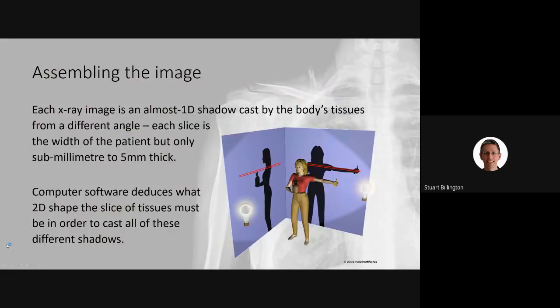Okay. So in a conventional X-ray, if you look at the image on the side of the screen there, the conventional X-ray would show you detail within the black shadow region. So it would be an up, down, left, right image that's taken by a conventional X-ray. But a CT scan only takes the part that's inside that red rectangle that I've drawn on there. So it's a slice in a different direction, a horizontal slice in this orientation.